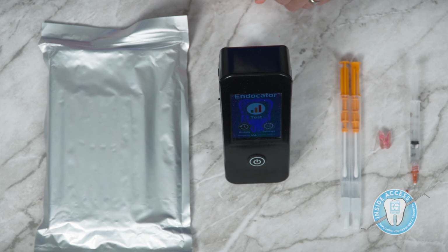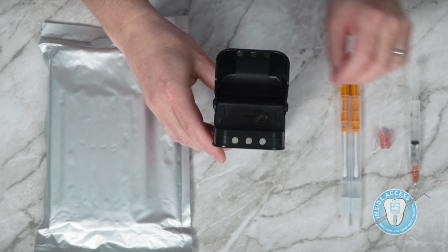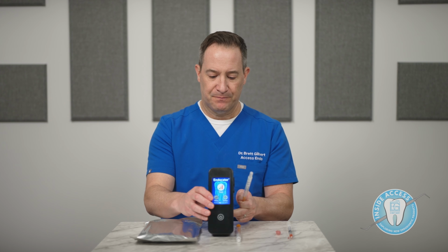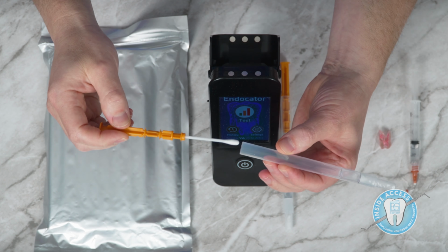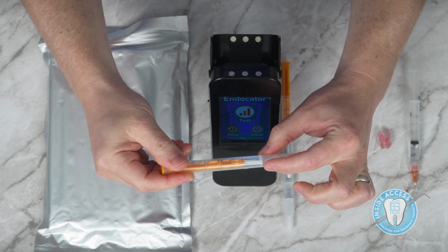The way that this works is very simple. It has a kickstand here, so you can stand it up as you see. When you lift the top, there's a little opening in there for this reagent tube. You would take the tube, and I'm just going to show you here, I'm going to use my mouth. Then this tube goes down into a reagent in the bottom, and there's a little fluid here.